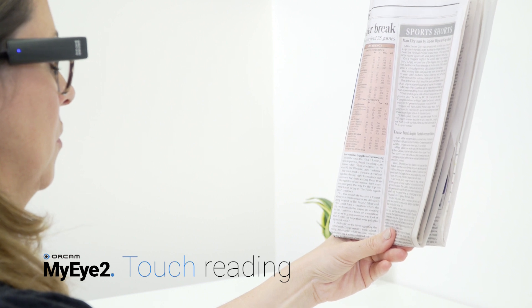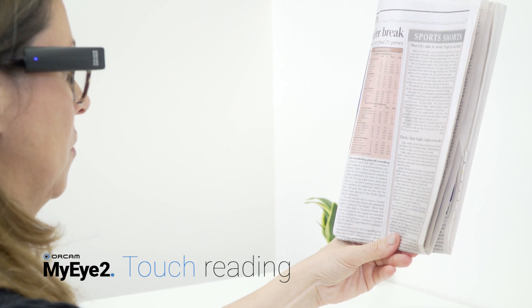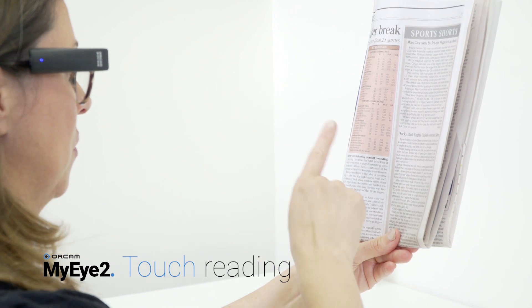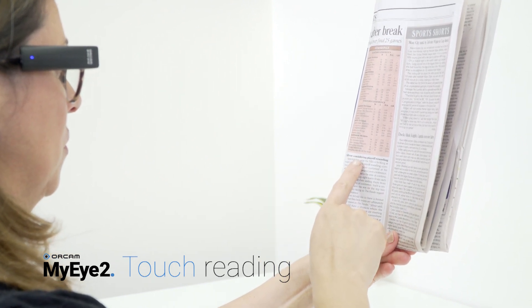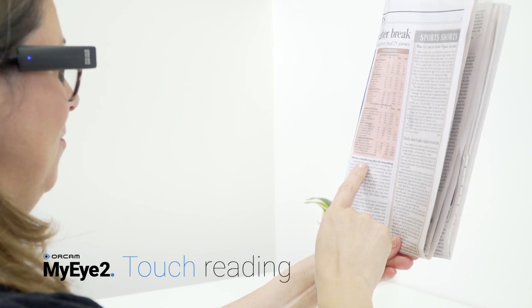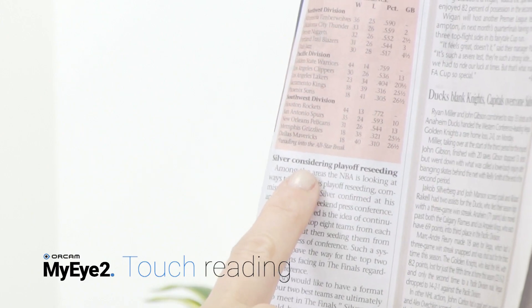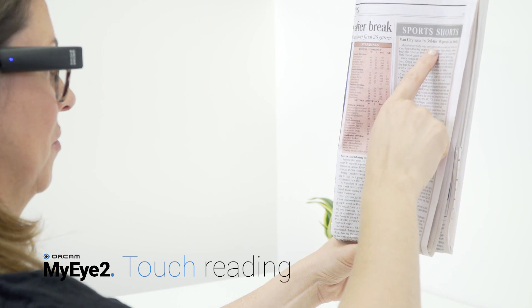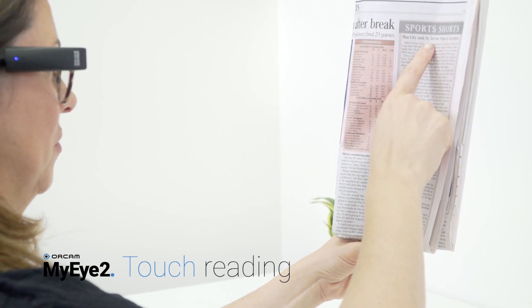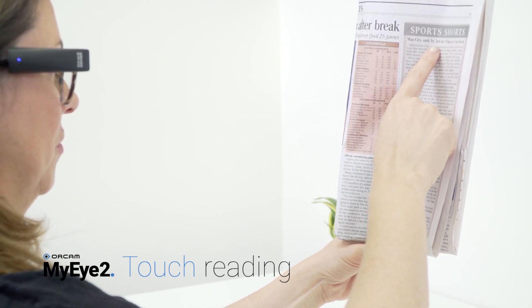Touch reading: use this when you wish to read a certain newspaper headline or a menu section. Face the text you wish to read and hold it steady. Point and hold your finger directly under the text you want to read, using the pointing gesture, until your OrCam device beeps twice. The device will start reading about three lines above your finger. To read a new section, slide your finger to a new spot on the page. Do not lift your finger from the page — the camera will follow your finger to the next section you want to read.